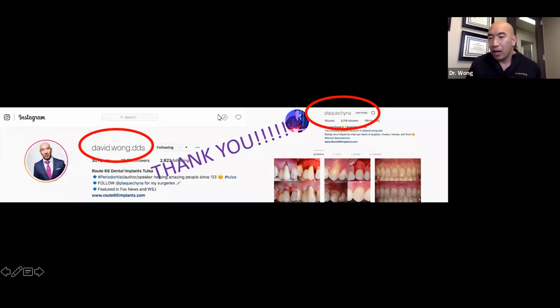And if you want to do that, that's totally fine. It actually does have some benefits because you'll get some soft tissue healing and coverage over that by then. So that's one good way to do it. I usually just graft it anyway, because I'm trying to minimize patient appointments. Just being a specialist, they don't want to come here that often. So that's just me. But the safe bet is to stage it if you're so inclined to do that.